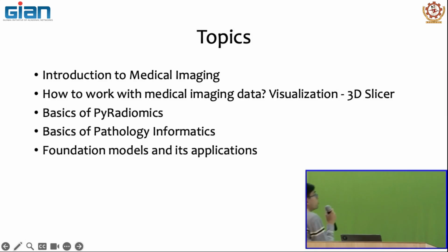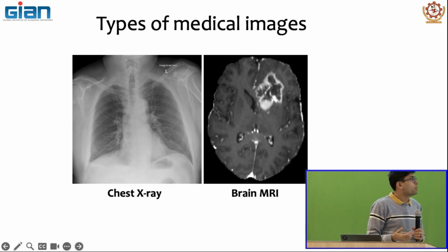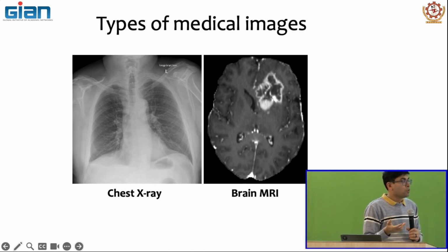Thank you. So I'll quickly go over some of the topics that Monak will cover in more detail. In the introduction to medical imaging, we saw how we can extract radiomic features from images like MRI scans, or if you remember, the lung vasculature extraction that was done on the CT images.